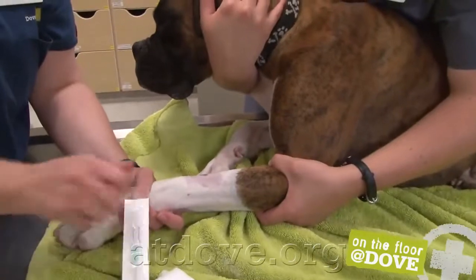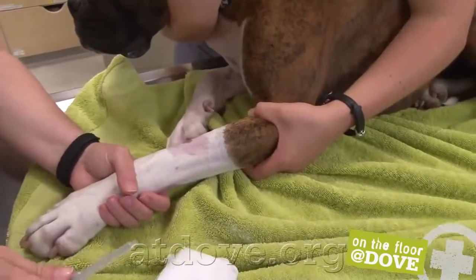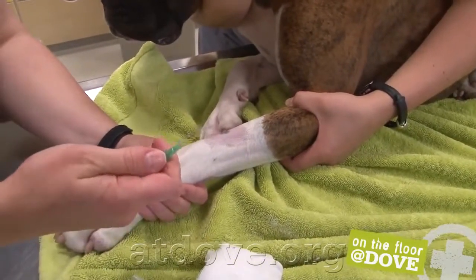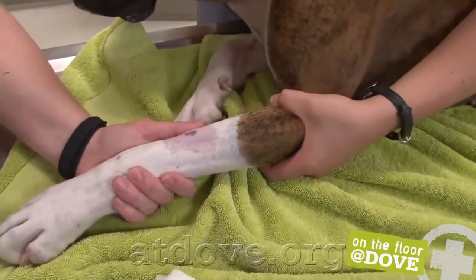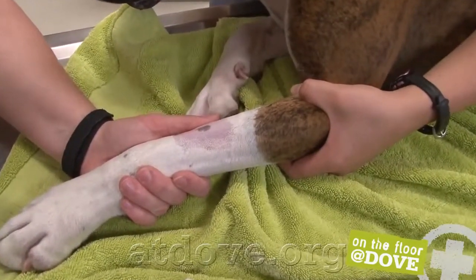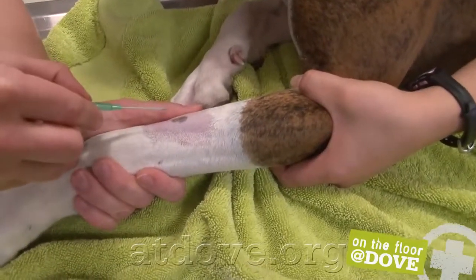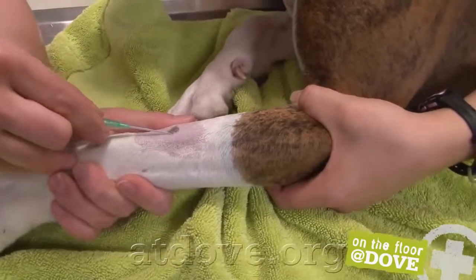So Catherine here is helping out. She's occluding the vein up at the elbow. I've got my catheter. I'm going to loosen the seal from the catheter and the stylet there. I like to put my thumb alongside the vein. You can see it kind of bouncing in there. That just helps stabilize. Right in about the center of where I clipped the hair, I'm going to poke.